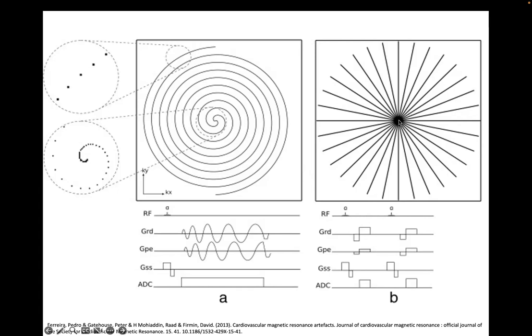So what happens is I put my magnetization in the transverse plane here. I pre-phase, so I go down to this location, right? Because I'm moving, with a kx and a ky changing with t. And then I turn around and go in the opposite direction. So I sample across here, right?